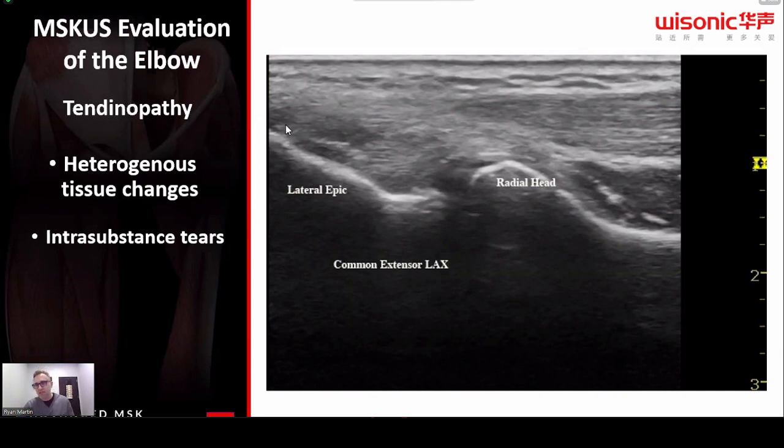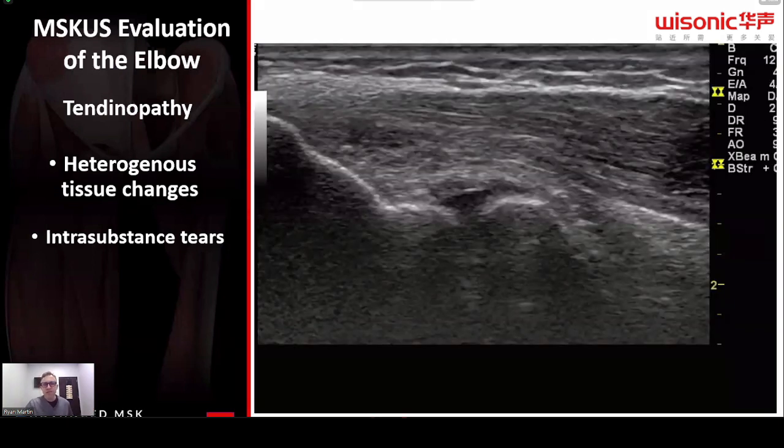It's very common in our clinics that we have somebody who says, yeah, I've had elbow pain before, it's probably been going on for a long time, and then one moment they had a snap, pop, and now they're in the clinic. Here's a good picture of another one that we looked at before.